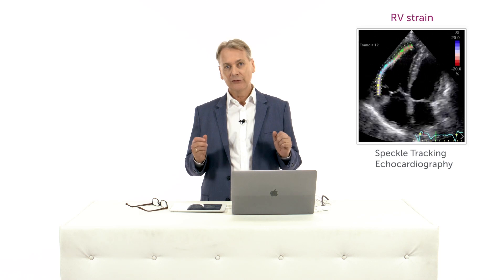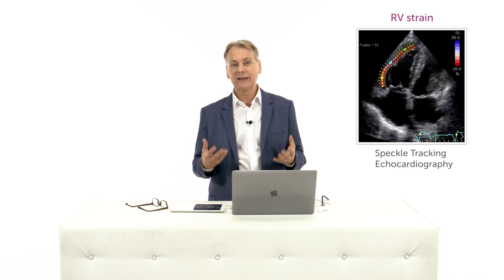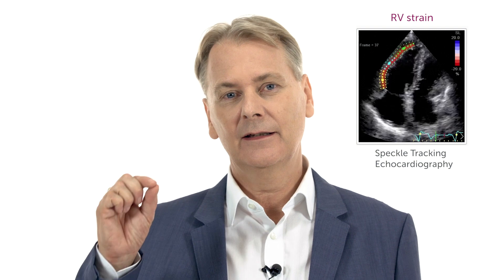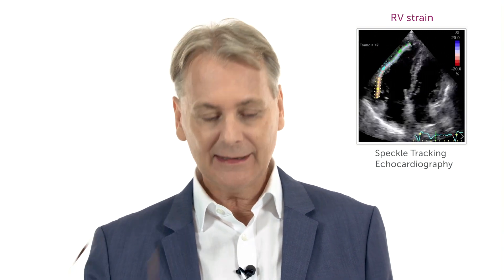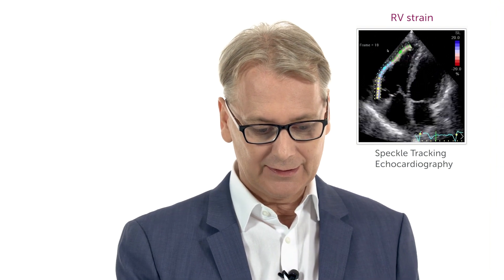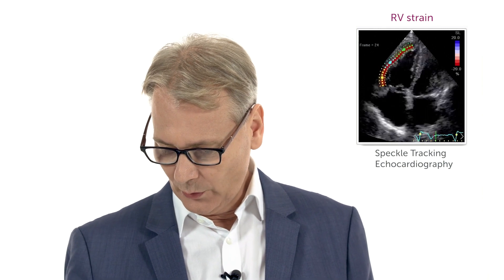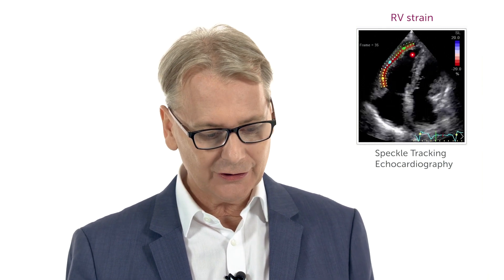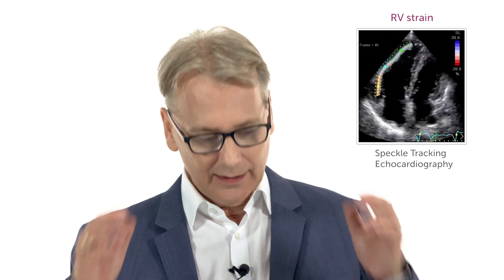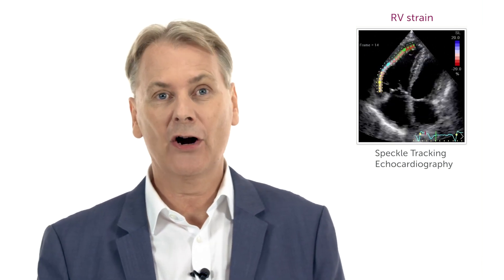Basically we're using a technology called speckle tracking. Here we are tracking the motion of these bright little echoes that you see throughout the entire myocardium. With this you're able to actually look at the percentage shortening of the myocardium.